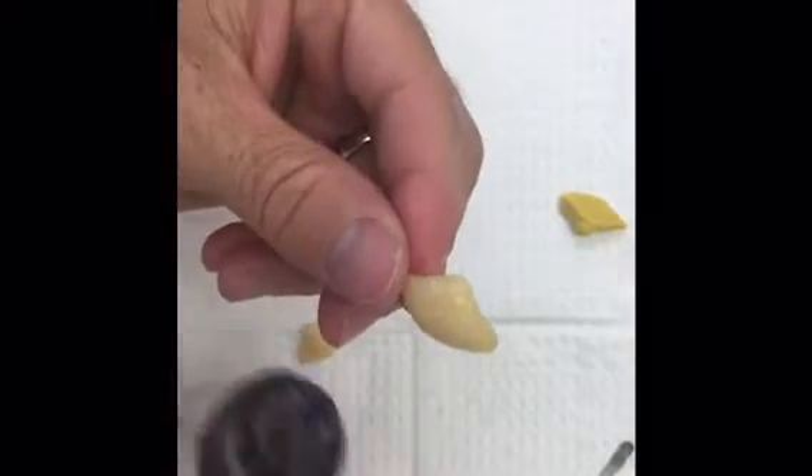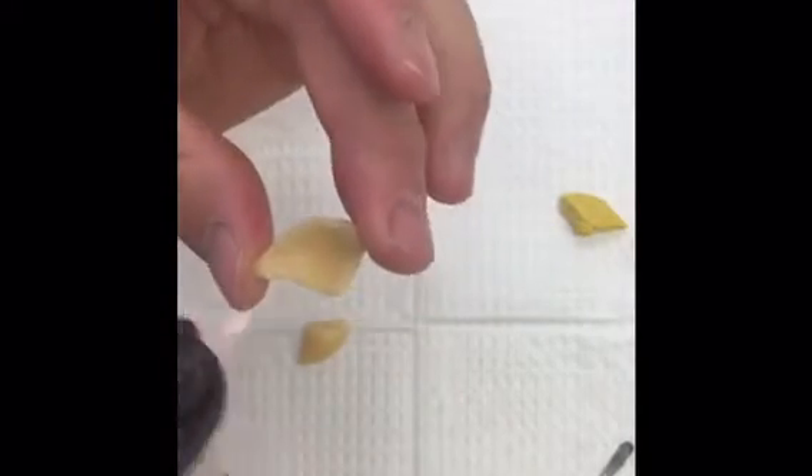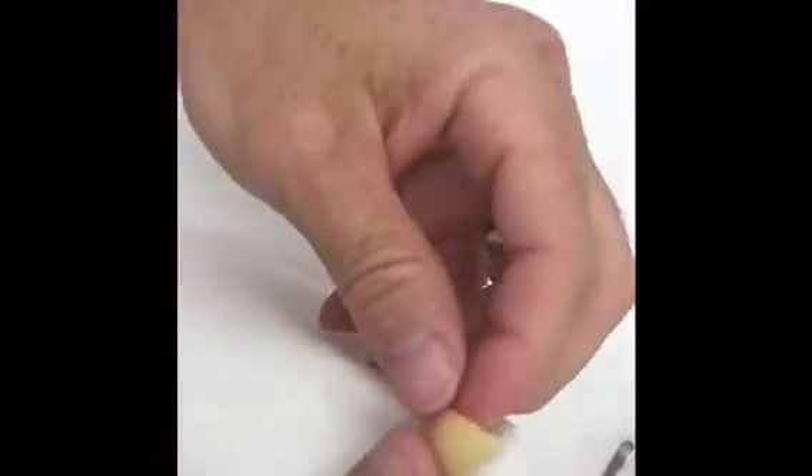You can also use your flame — this torch is nice because it's got a little pinpoint. Another thing you can do is use a dry paper towel and pull it across. You can get in there on the inside as well with a corner. If you use a little bit of eyewash or water — even some mineral oil — that might be a nice lubricant to try it in the socket and see how it fits.